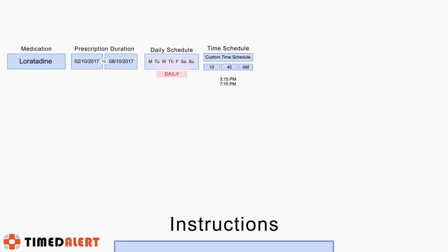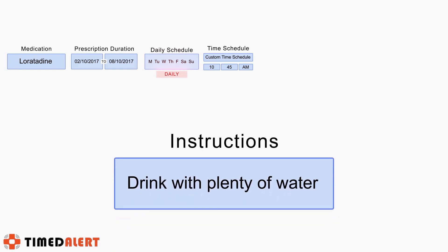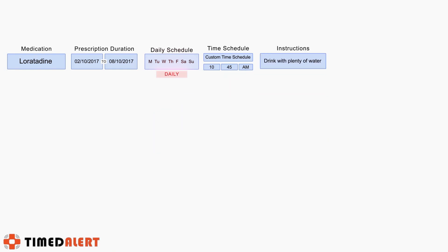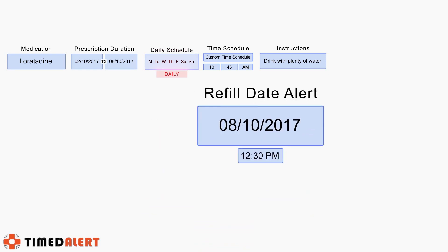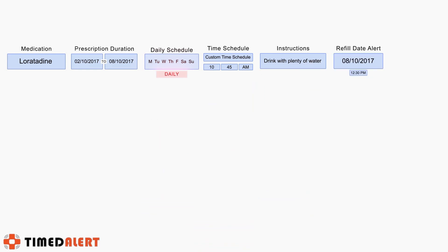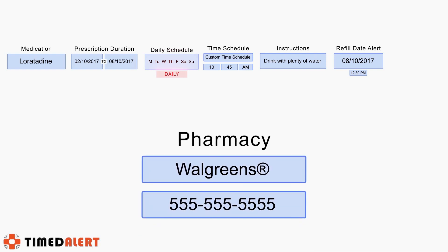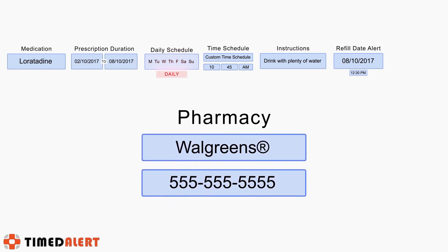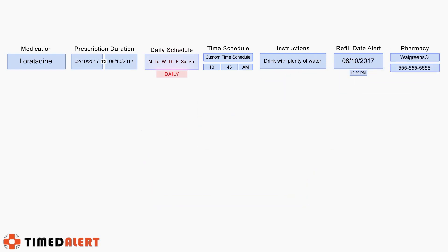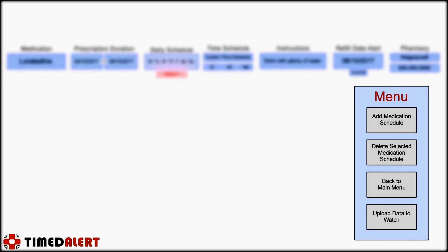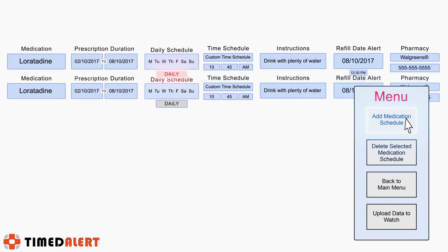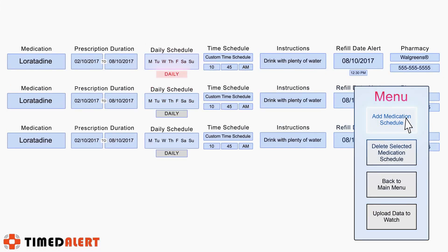Next, you can optionally enter any instructions for taking the medication and also a refill date and time. Additionally, if you like, you can enter the name and phone number of your pharmacy, which would be displayed by the watch alongside your reminder alert. If you would like to add more prescription schedules, click on the add medication schedule button once again to fill out an entirely new template.